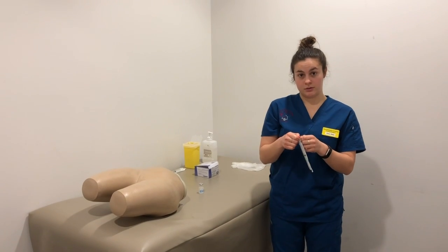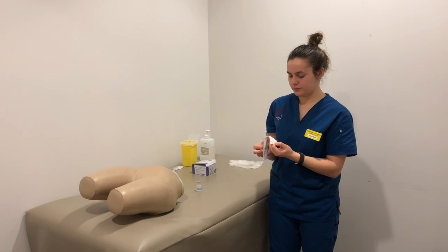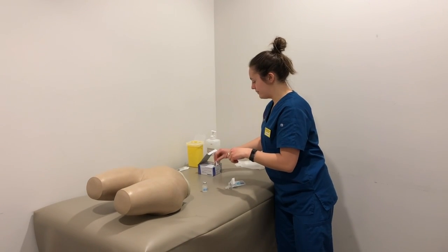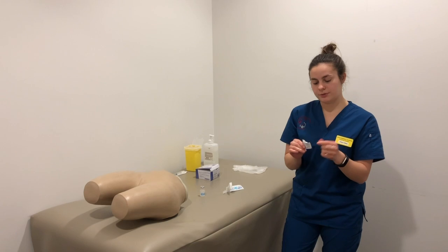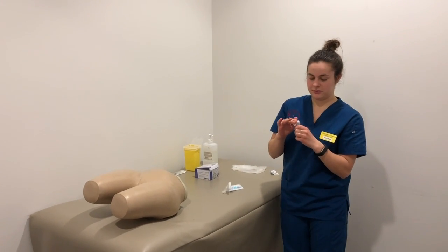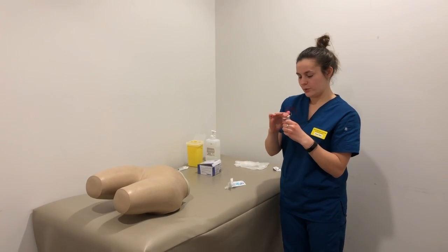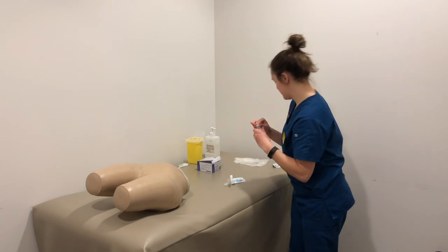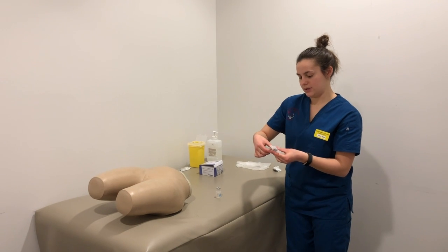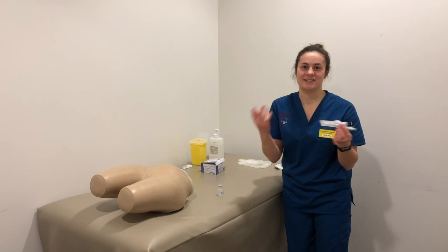I'm going to open this needle, and this is a multi-use vial, so I will be cleaning it with an alcohol swab to ensure appropriate safety techniques and infection control. So I'm just going to make sure I wipe the top of the vial. Okay. So as I said, for this it's the subcutaneous injection, so I'm using the smaller gauge. It's actually a larger gauge number, but in reality it's a smaller diameter.